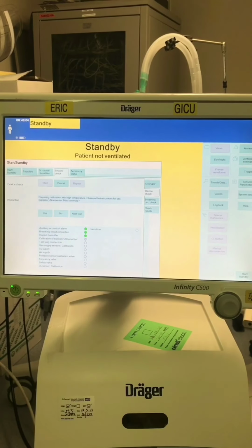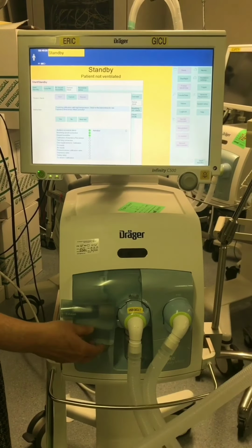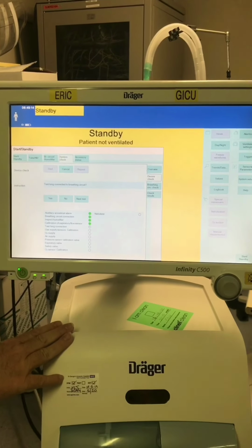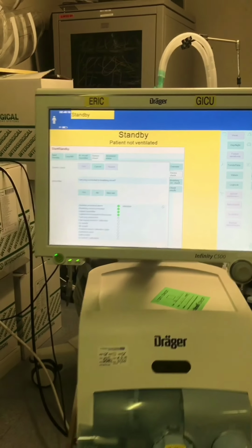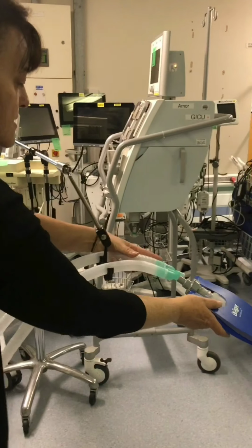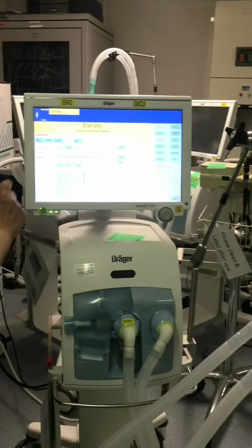Is the expiratory flow sensor connected correctly? Under this flap, if the flap is present, yes it is. So I say yes. Now it says test lung connected to the breathing circuit. We use these test lungs, the Draeger test lungs. So I'm going to connect that to the end of the circuit and say yes.